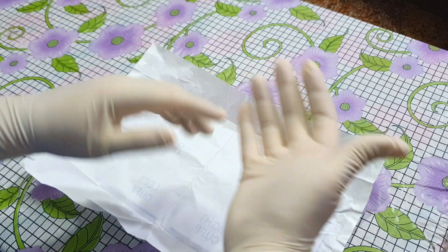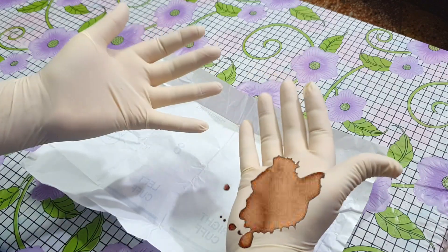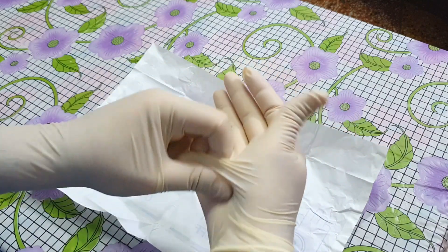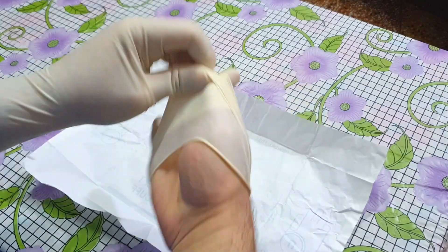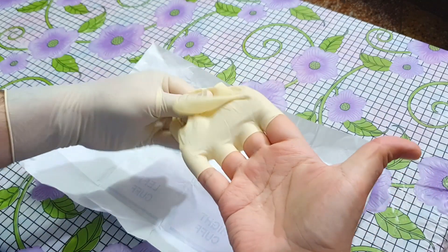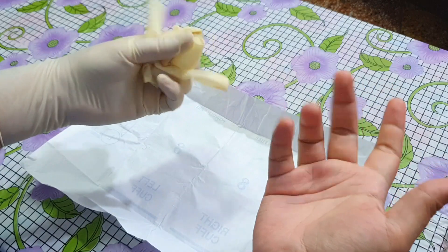Suppose you have done your surgery and now your gloves are stained with blood or infective organisms. Now you will try to remove the gloves without touching the outer stained surface. Here is the technique: hold the glove inside the glove and remove it like this. Note that the glove will become inside out while removing, so its outer dirty surface is not touched.